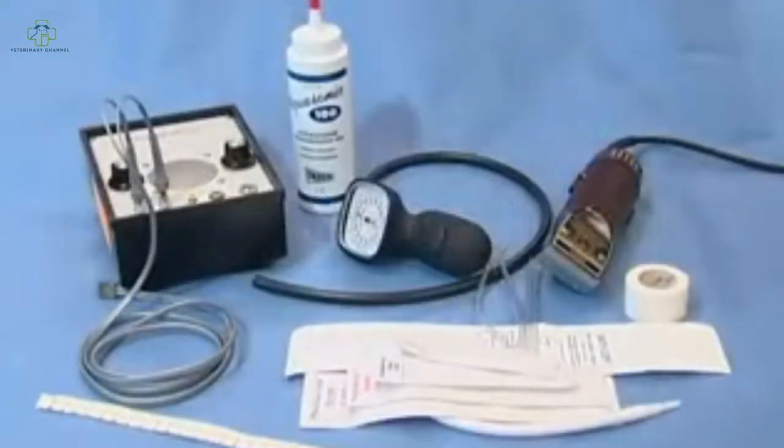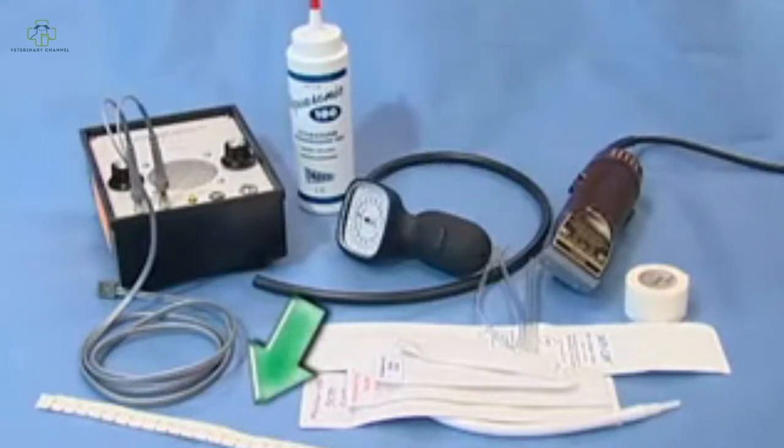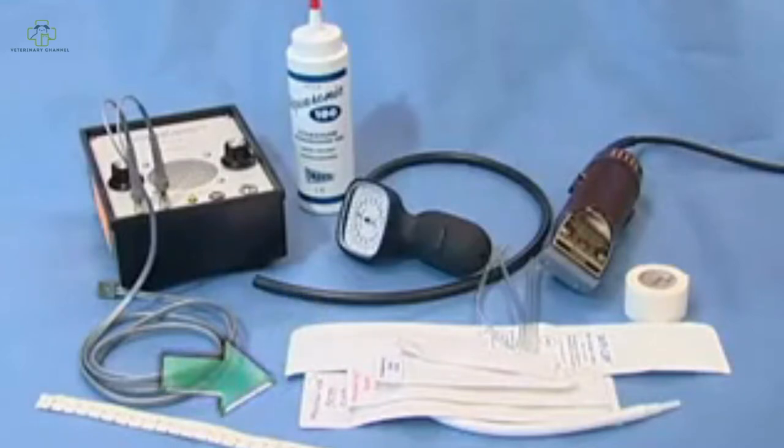Here is the equipment required for Doppler blood pressure measurement. You have the ultrasonic Doppler flow detector along with the probe, a sphygmomanometer, coupling gel for placing the probe over the artery, a measuring tape for determining cuff size, a selection of cuffs, white tape, and clippers.